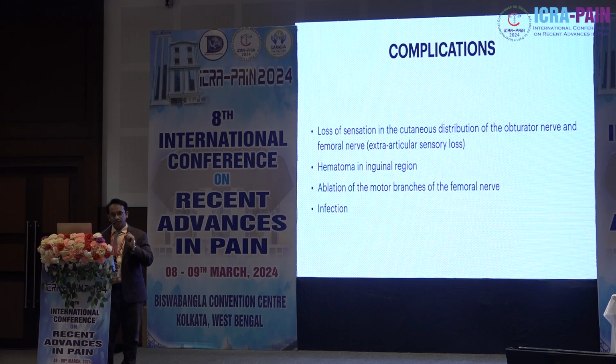When you are doing the ablation, the stimulation becomes very important because you will keep getting the adductor muscles stimulated. So you have to place your needle at the exact point so that the stimulations are as few as possible in the obturator region, and then you can start the lesioning.